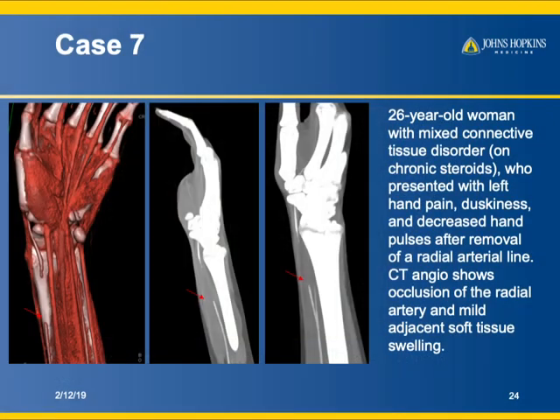A 26-year-old with mixed connective tissue disorder presenting with left hand pain, duskiness, and decreased hand pulses. Looking at the radial and ulnar arteries, you can see occlusion by thrombus of the radial artery — just a beautiful example.